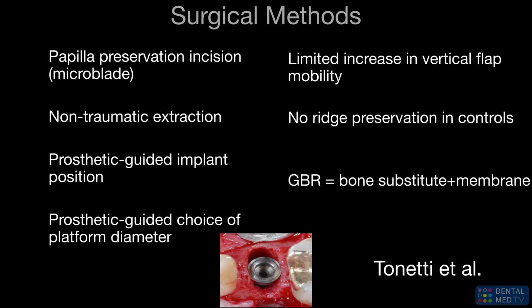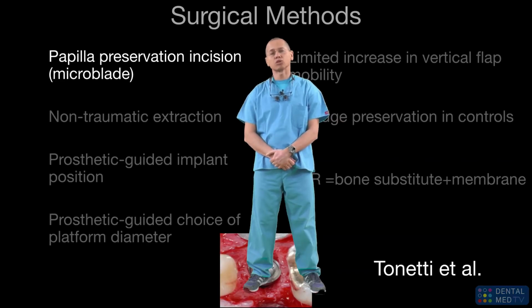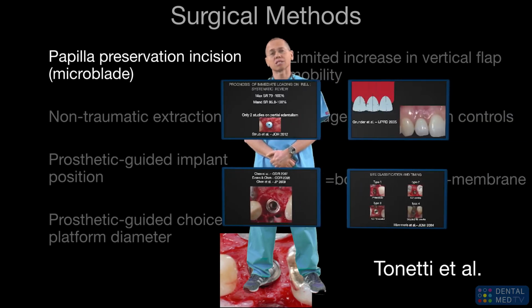But we have to focus on a critical aspect: the two surgical methods compared in such research were the best technique ever used, the state-of-the-art procedure, for delayed implants, but an old approach for what concerns immediate implants, because in all the cases papillae were cut and elevated, and a flapless procedure, which is the gold standard of such a surgical treatment, was not used. Therefore, let's see what is crucial for achieving optimal aesthetic results on immediate implants.